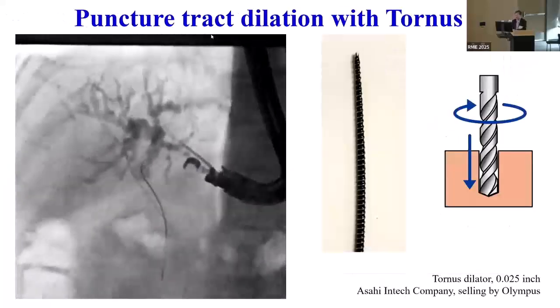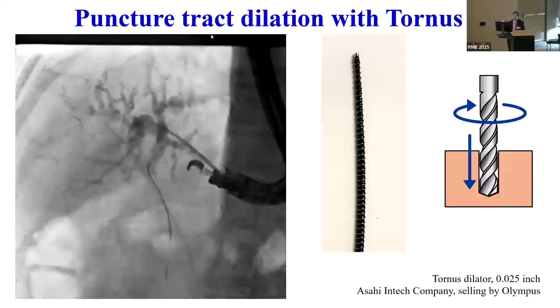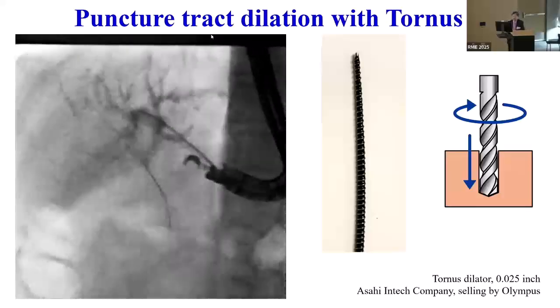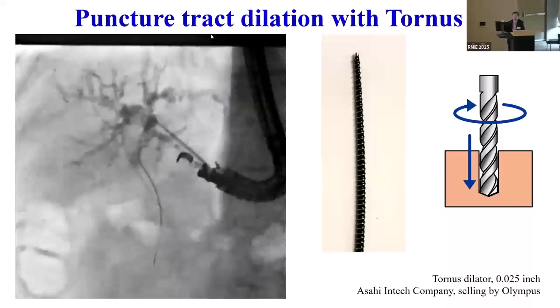And the other good equipment is the Tornus drill dilator. Maybe this equipment got FDA approval some months ago.